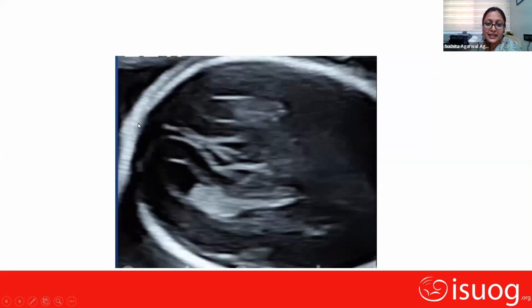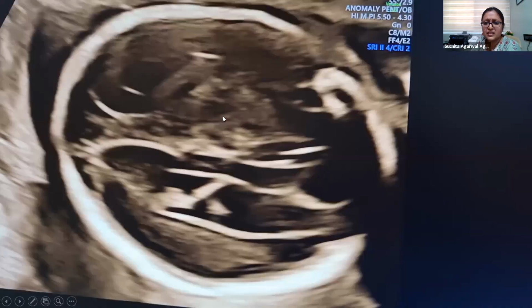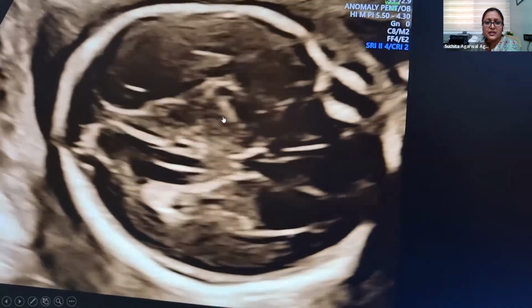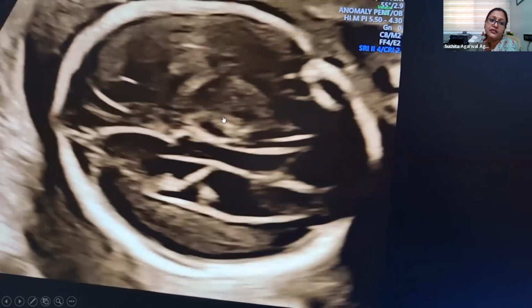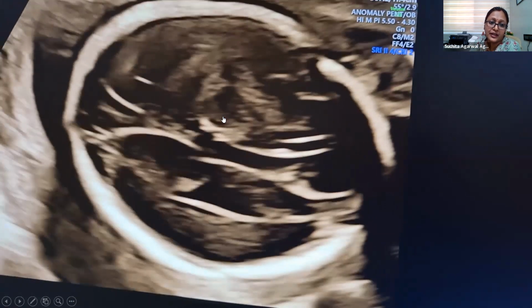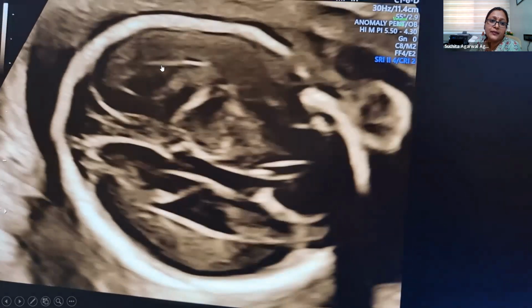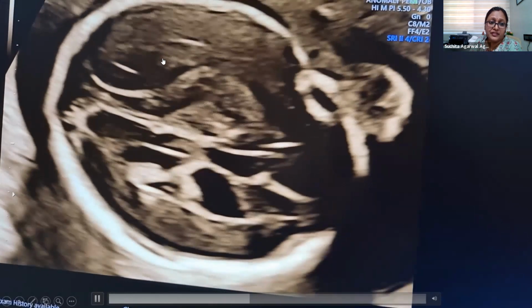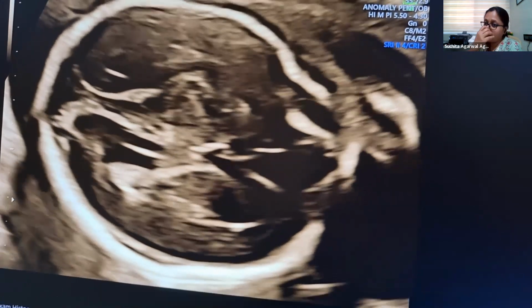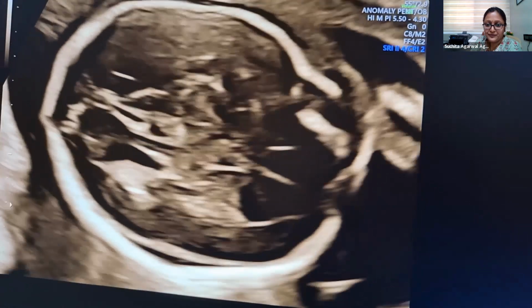So at this level, you see, this is an axial section, a symmetrical axial section. At this level, we can measure even this ventricle. This near ventricle also can be measured. This is one video which I have taken. So just tilt the probe a little bit oblique. We get it a little bit open, you can get the near ventricle. See, we can see this one. And at least eyeballing can be done. We need not measure it in all cases, but eyeballing has to be done in this case.